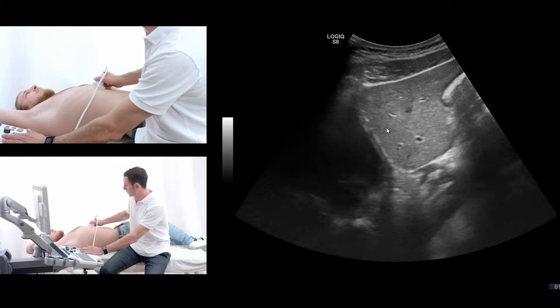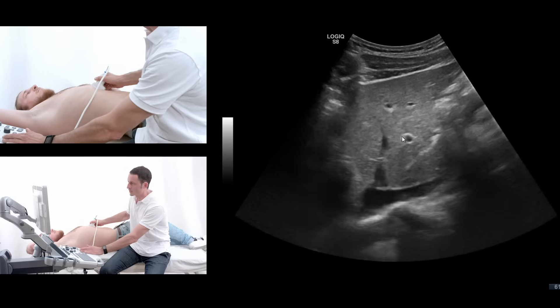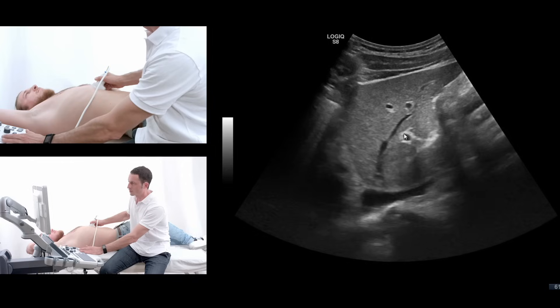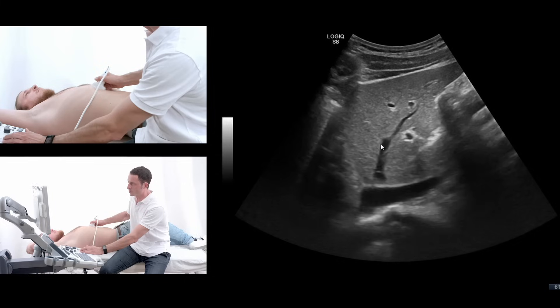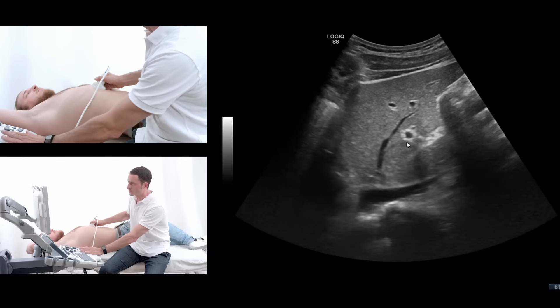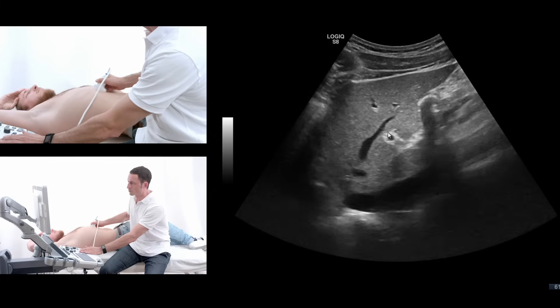When I push the probe more to the right side, I come more to the liver center, and you see two different structures. You see the echogenic circling around the portal vein, which is the tissue around the portal vein branch. And you see the structure that has no echogenic structure around it, which is the liver vein. So this is the difference between the portal vein and the liver vein — there is no connective tissue around the liver vein.